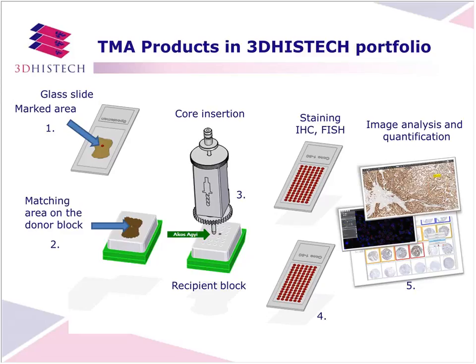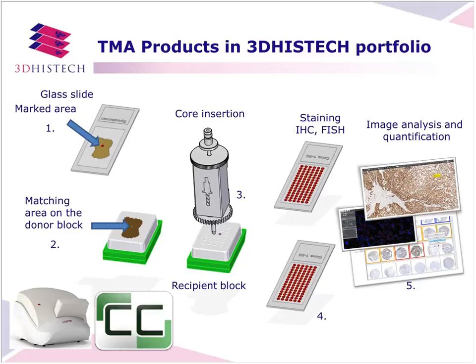This TMA block can be sectioned and stained for immunohistochemistry or for FISH. During this TMA workflow, our tissue microarrayers integrate nicely with other 3DHISTECH products.